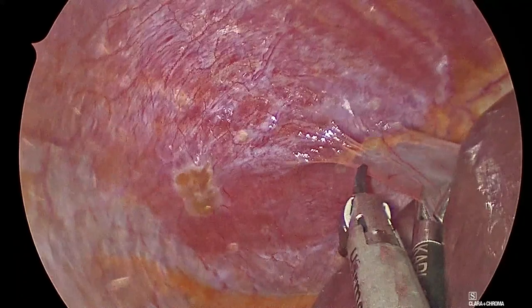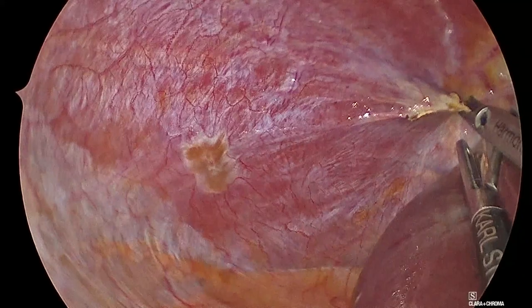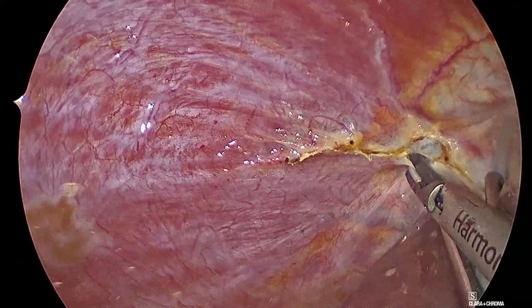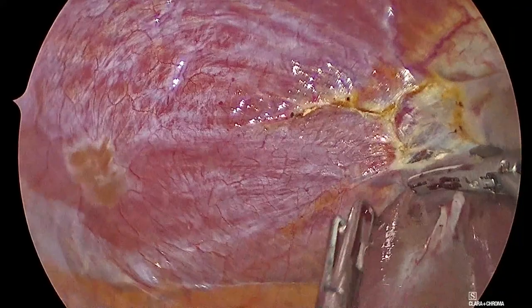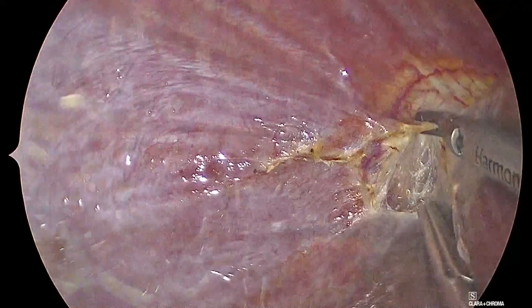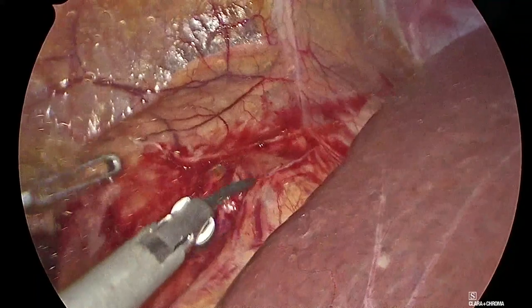Do you want to explain a little bit about the risk of the CO2 and the seeding of metastasis in laparoscopy? Explain the role of the CO2, of the gas, that may be responsible for... I don't think that CO2 has a huge role in the seeding, but if you open a lymph node that is positive, or if you open the renal pelvis, then CO2 may interfere. But more than CO2, I think it is the pressure that we are using. If you use high pressure, then of course the risk of seeding is higher. Despite this, if you are oncologically respecting the templates, so respect the ureter, respect the lymph nodes, I don't think that laparoscopy, or robotics, gives a higher risk of recurrence. I don't know what you think.